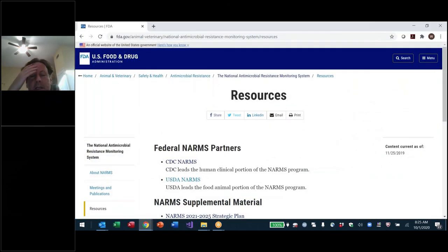One of the things in Vietnam is the initial report was way too long. They were doing everything by blood and urine, and it was just too many tables. No one's going to read all of that. It's nice to have it on an interactive website, so if somebody wants to, they can generate it themselves. But you want a document that people can read.